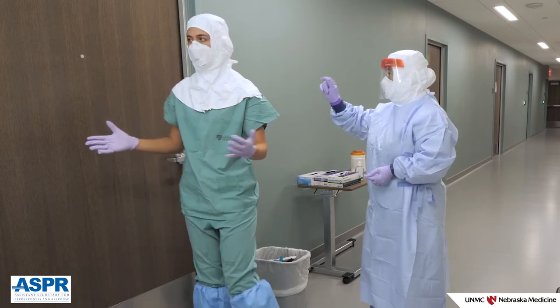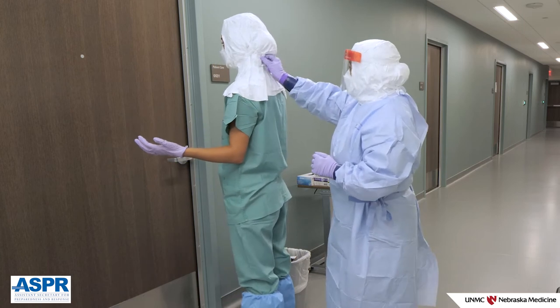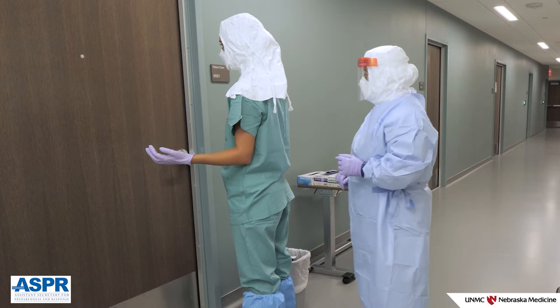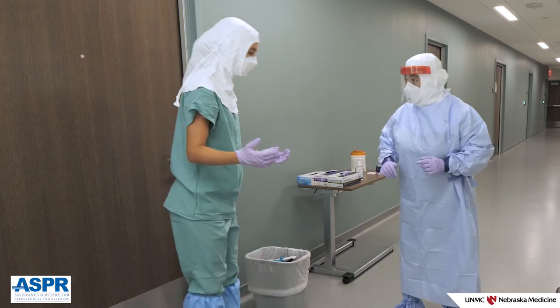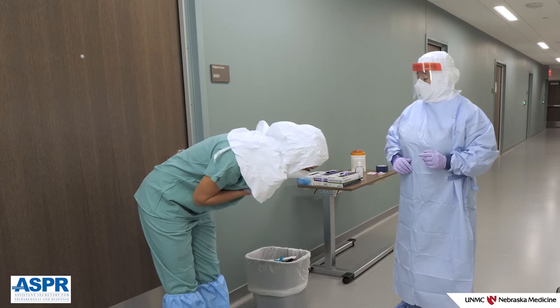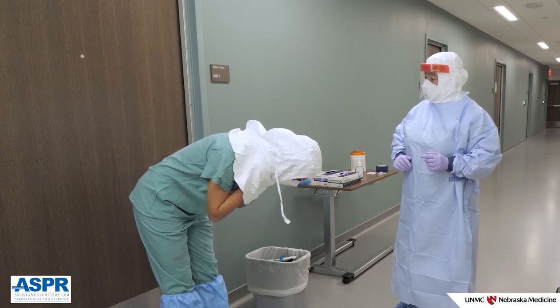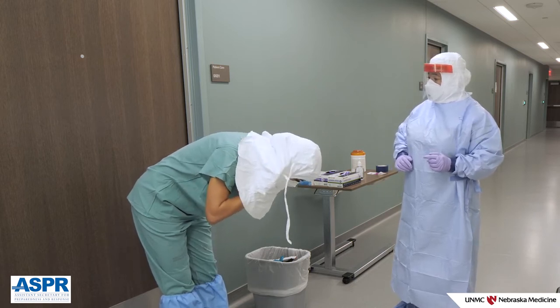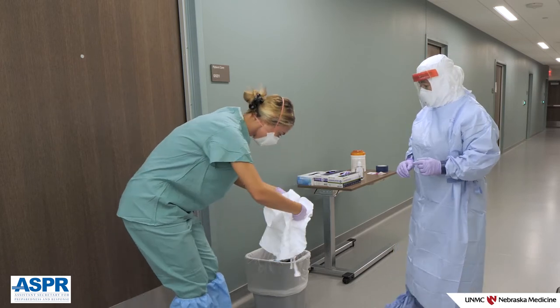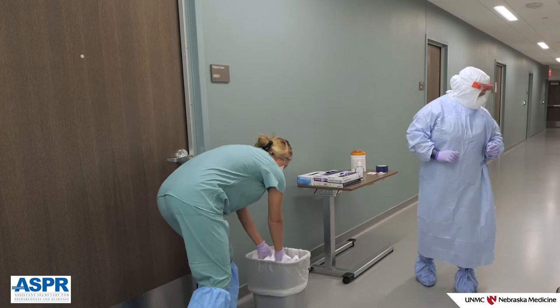The doffing partner should now release the ties on the hood. Once removed, gently place the hood in the waste container.